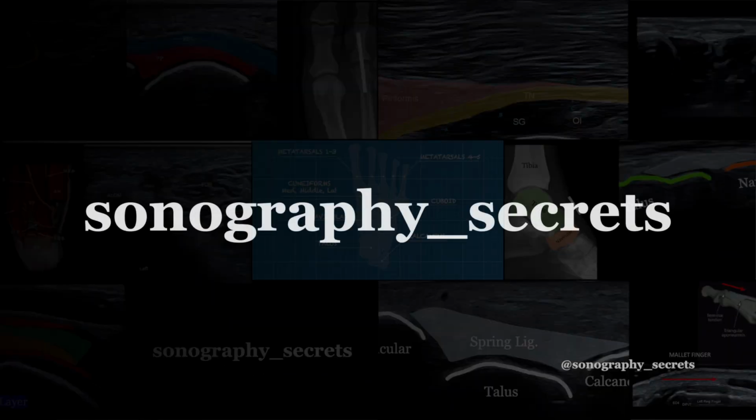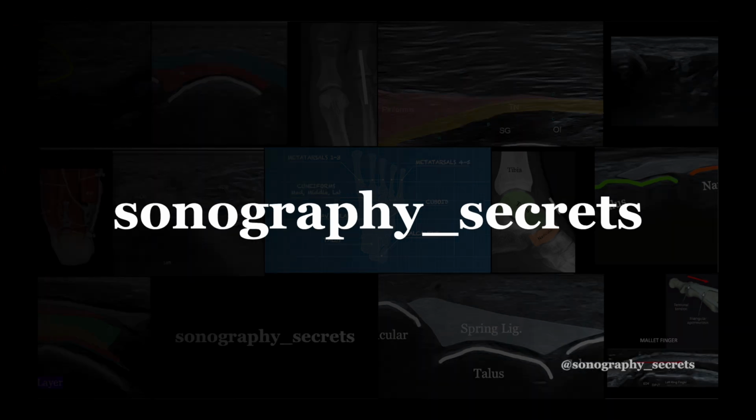And there were a few other questions too. One really good question was regarding measurements of tears. So you'll notice with the majority of my scanning, I was scanning in short axis or transverse. So that's not by coincidence. Essentially all of my scanning for whatever MSK examination is in short axis. Once I see a tear though, I will try and measure the length and the width of that tear and give the radiologist or the surgeon an idea as to the size of the tear.